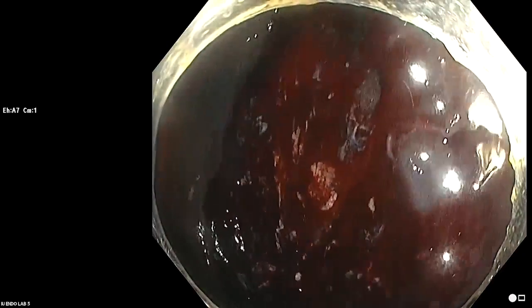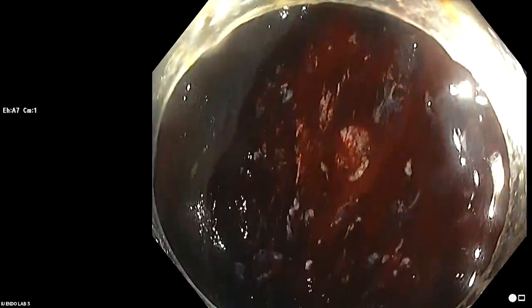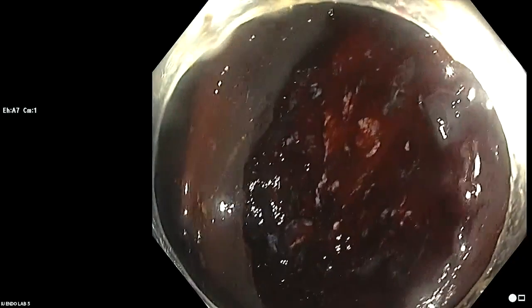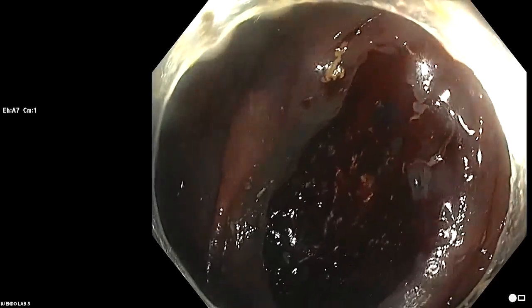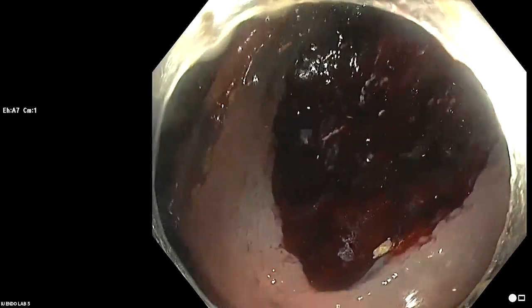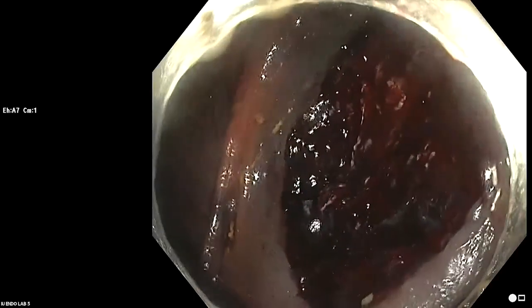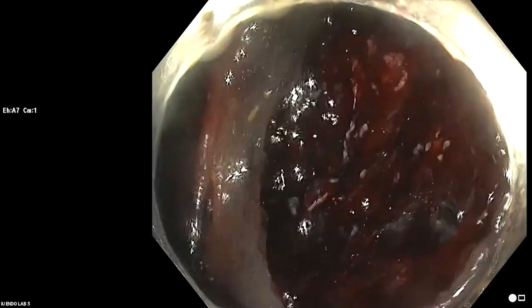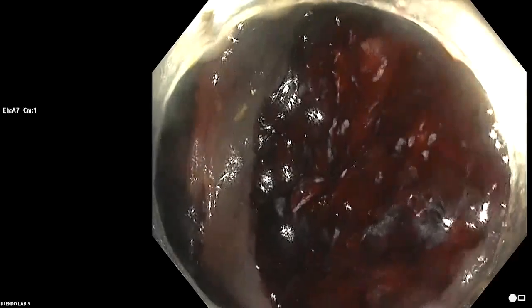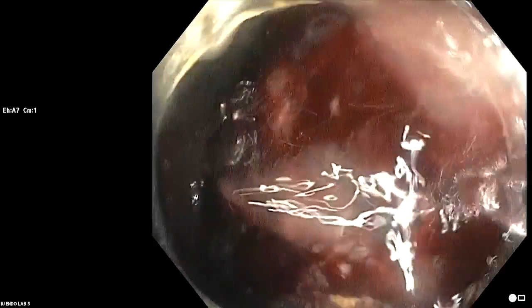So we don't have a trial looking at using snare tip soft coag or APC to the margin of cold resections. You could theoretically predict, or at least my prediction would be, that it would not work as well as it does with adenomas removed with electrocautery, because when we use electrocautery, we cut deeper than we do with cold snaring. So probably what drives recurrences with cold snaring is a resection that doesn't always get down through the muscularis mucosa into the submucosa. But nobody's done that study yet, and I personally don't do that.